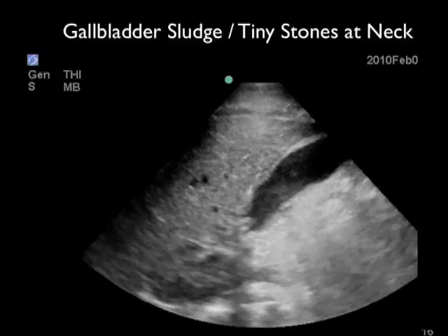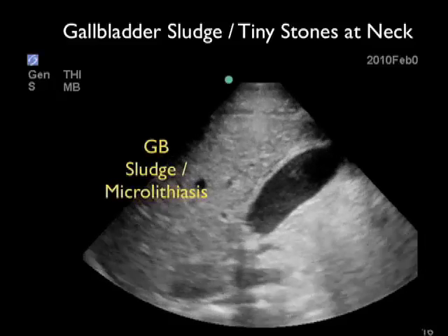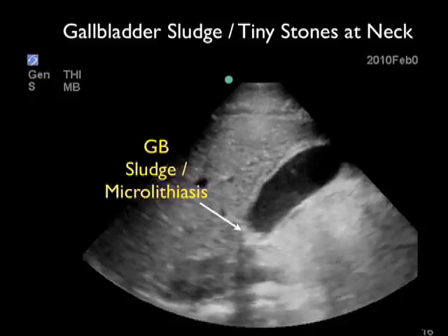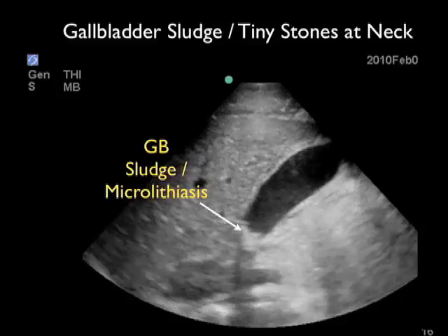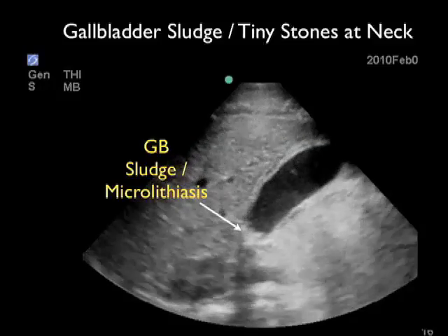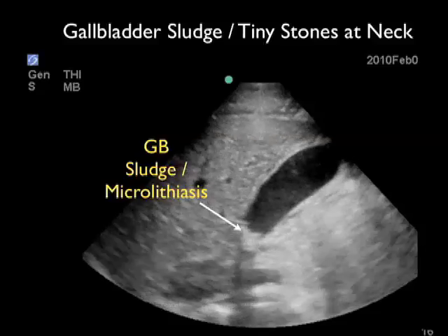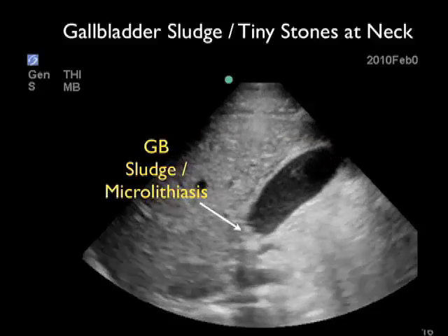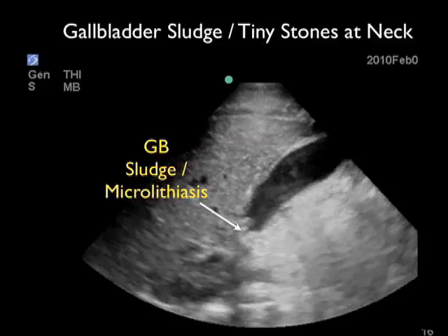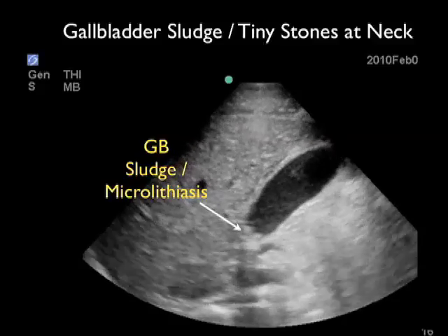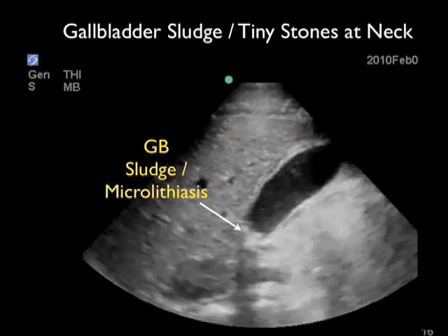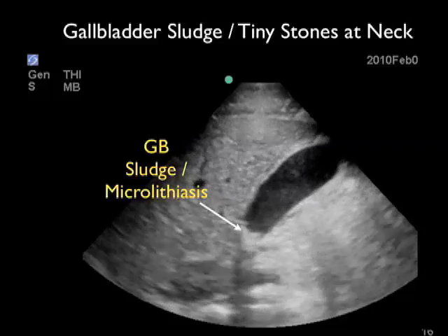Here's a video clip from a young male presenting with right upper quadrant pain. As we're looking through the gallbladder, we notice a finding within the neck of the gallbladder. We see a concretion of gallbladder sludge and also tiny gallbladder stones known as microlithiasis. Notice that the microlithiasis has posterior acoustic shadowing due to the blocking of sound waves through the concretions of cholesterol crystals — an interesting finding on the spectrum of gallbladder disease.